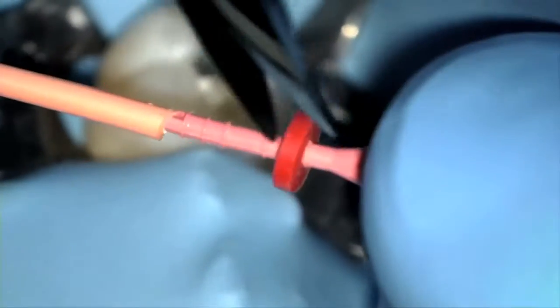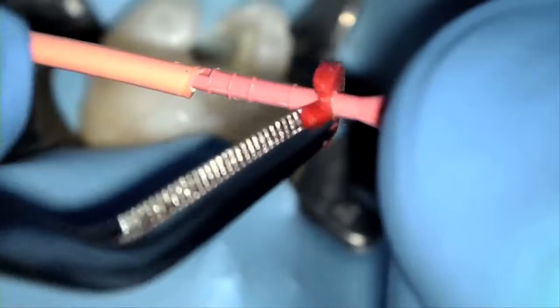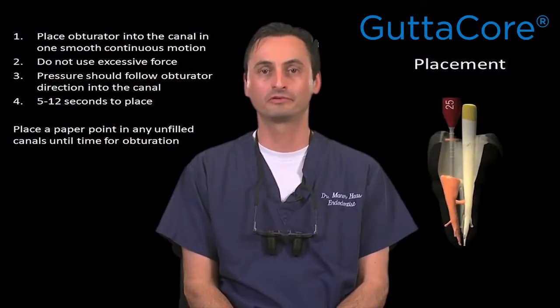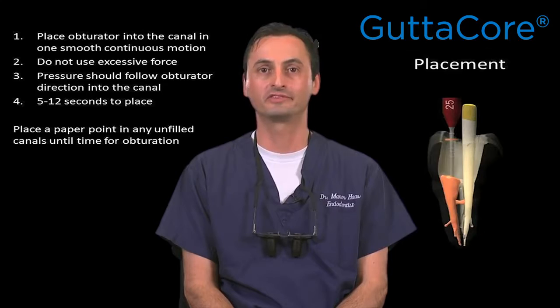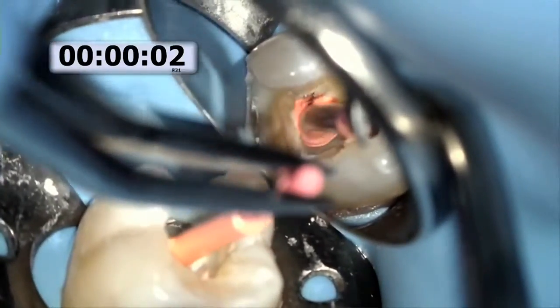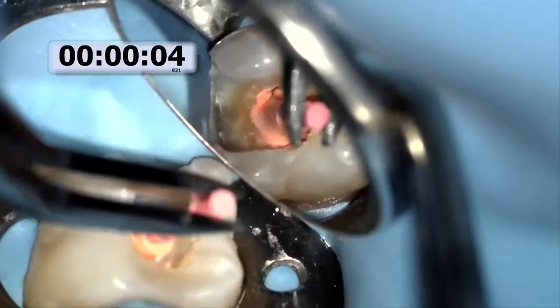Something you may want to consider is cutting the rubber stopper off the cold GuttaCore obturator prior to placing it in the oven, as you can see in this video. It's nice to have the rubber stopper as a marker, but I personally find that removing it makes visibility even easier. The placement of the warm GuttaCore from orifice to apex should be done in about seven seconds. I cannot stress this enough, as this is one of the most important aspects of obturating with GuttaCore. It seems so simple, but I find that all too often dentists insert the GuttaCore too quickly.